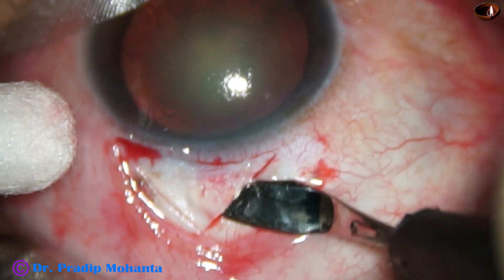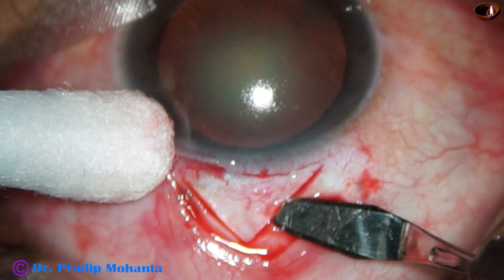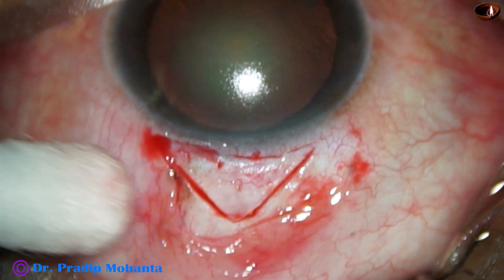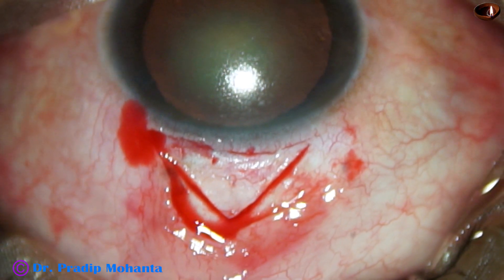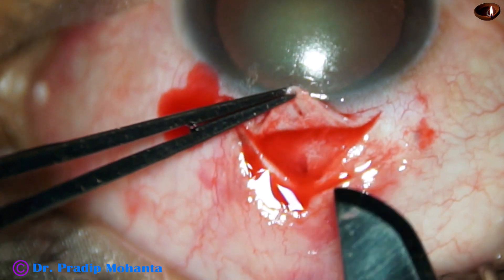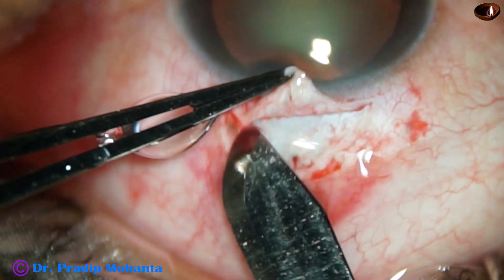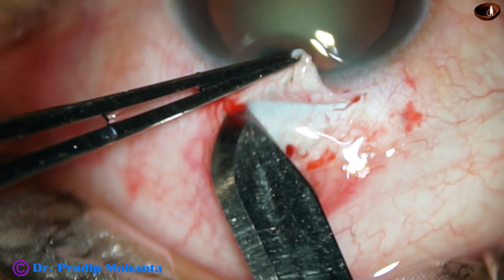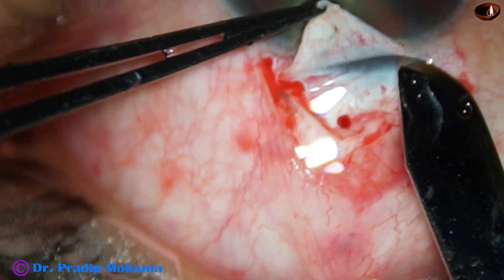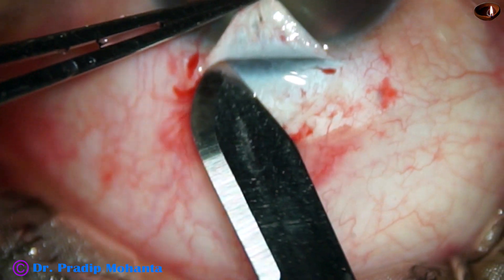Now I am going to use a crescent blade to dissect the flap. More than half of the flap is dissected by the crescent blade. And now I take the number 15 Bard-Parker blade again, hold the flap with a tooth forceps, and very carefully go towards the limbus. At this time my aim is to make the flap thicker at the limbus so that there is no buttonholing of the flap. Yes, we have reached the blue zone.